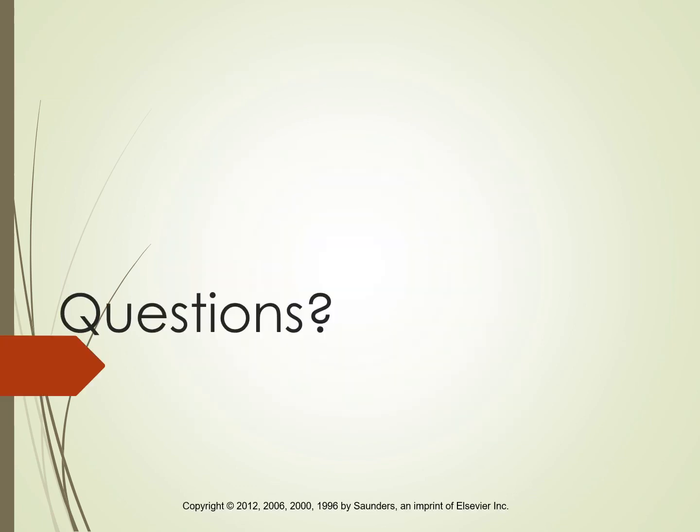All right, so that was that. Probably the most important chapter you'll see for this course. There's a lot of other very important chapters, but periodontal disease for a dental hygienist is pretty important. Being able to recognize it on a radiograph is pretty important. I'm sure these are things that, especially if you've worked in an office, but even if you didn't, you were already starting to look for this sort of bone level thing. And I'm sure when you see it, you already recognize that, hey, that's not a good thing.